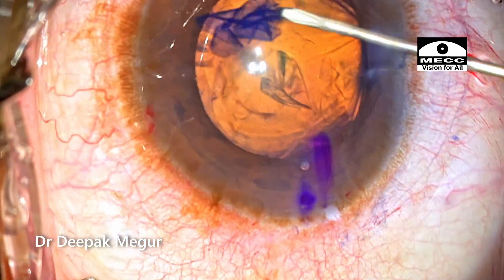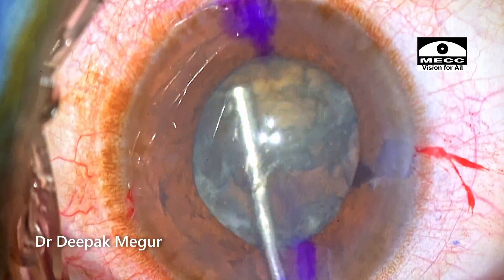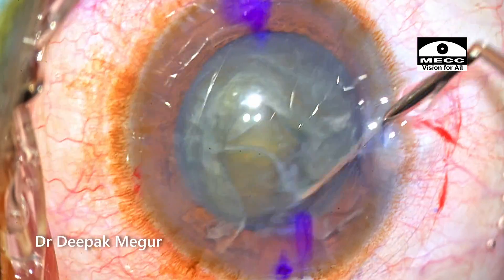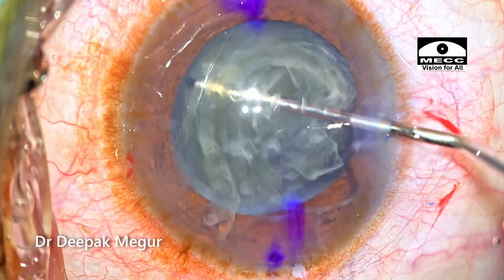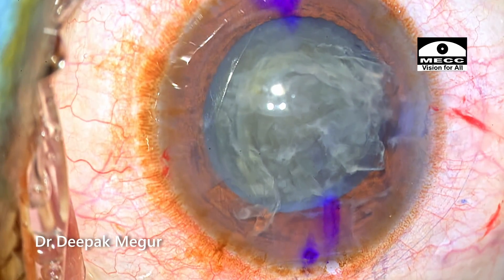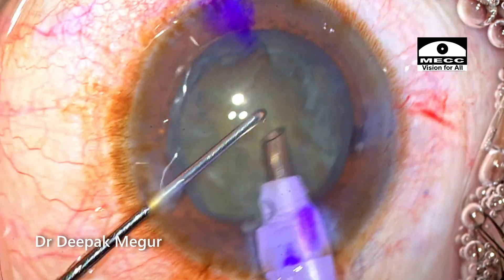The rhexis is being done and I'm using a blunt chopper to confirm the nucleus rotation. At this point I really can't make out at what stage the Descemet's membrane detachment actually happens, and as we proceed with the surgery, I'll show you when I first noticed it.